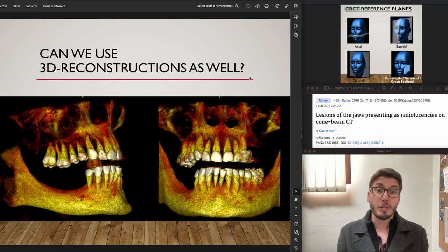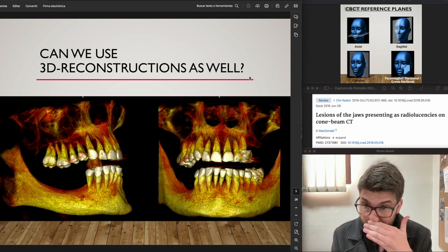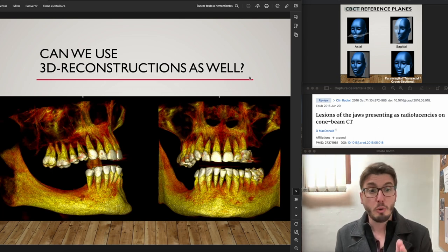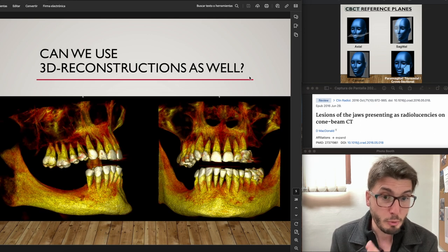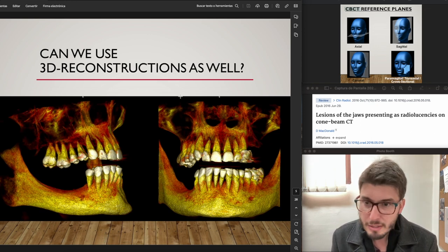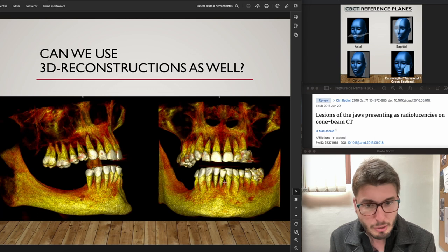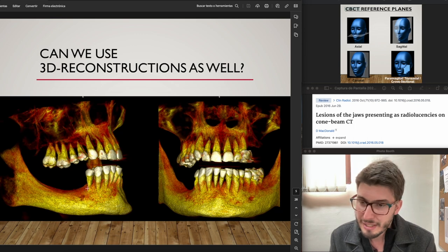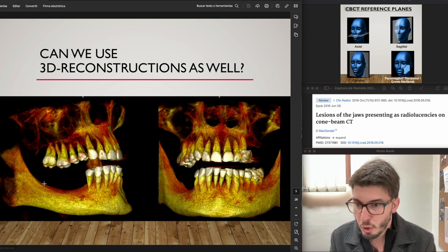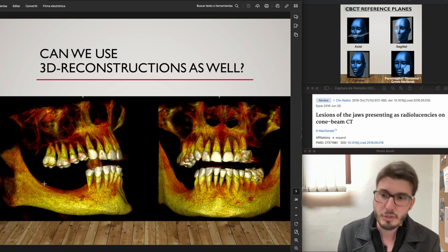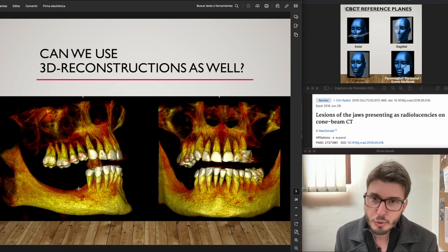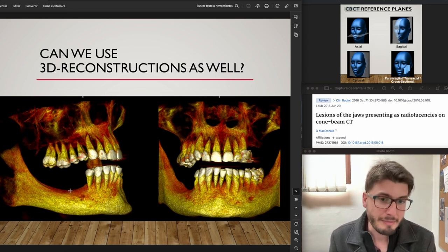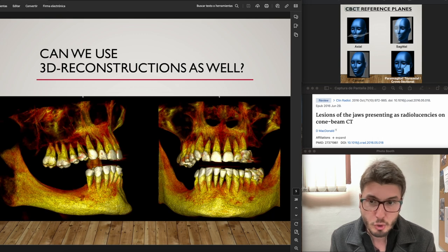Can we use 3D reconstructions as well? Yes, to complement the diagnosis, but the diagnosis is made on MPR images — on multiplanar reconstruction. For surgical planning you can see things in 3D; 3D reconstructions are useful for that. But the MPR is the one that needs to be used properly to diagnose conditions.